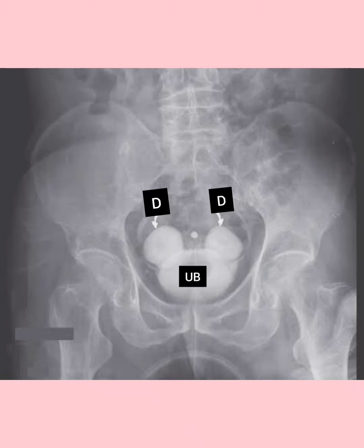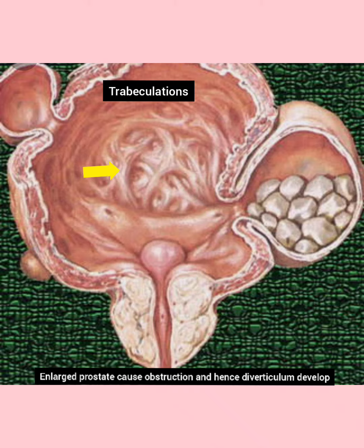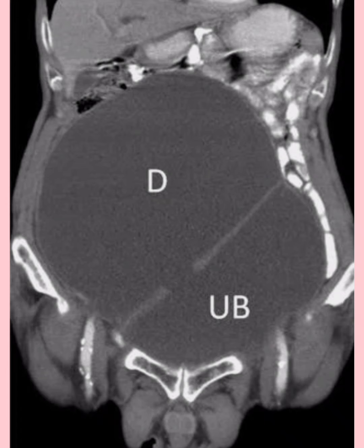Here are some more pictures. This is the scan with a full bladder, and this is the micturating cystourethrogram. This picture shows the causes and complications of bladder diverticulum. There are stones visible in the bladder diverticulum, which are due to stasis and infection. One of the causes is an enlarged prostate.